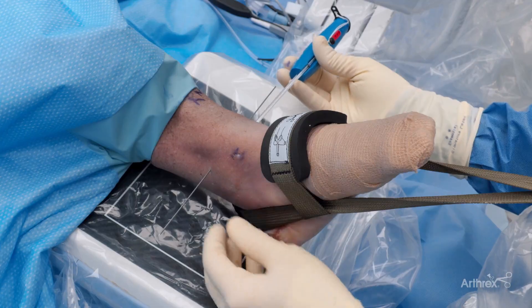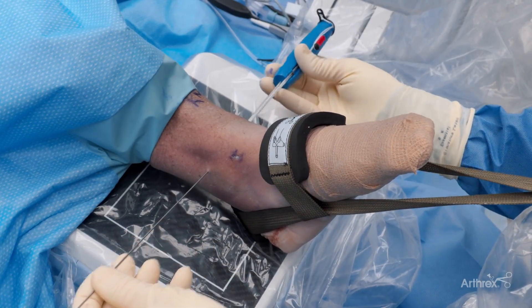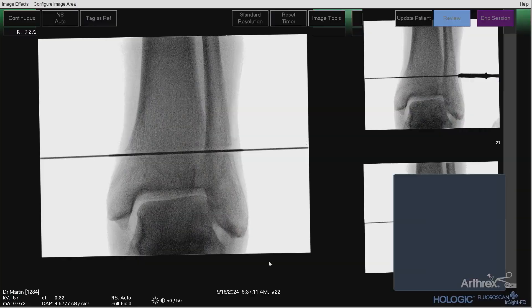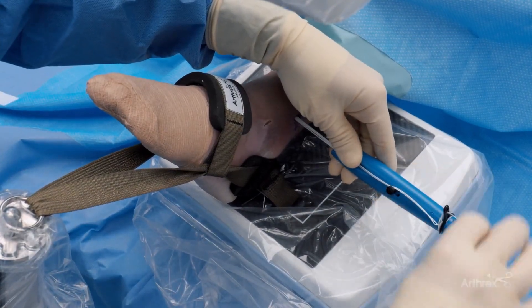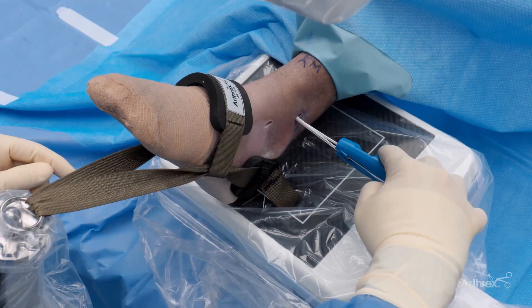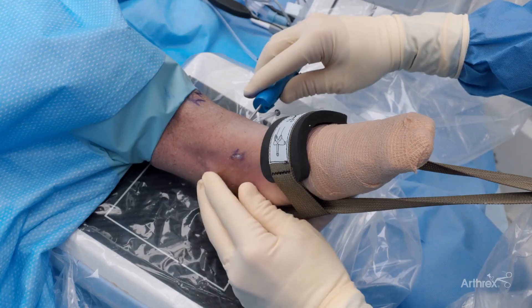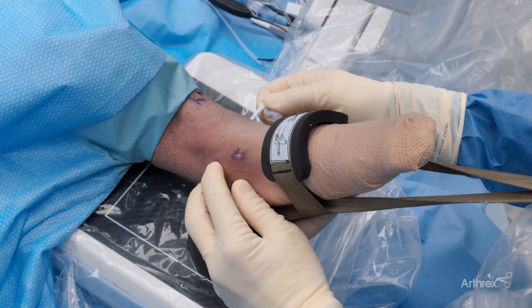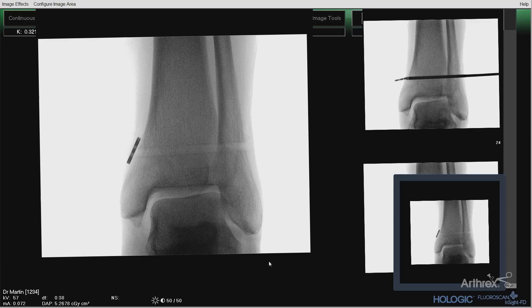Now that we've drilled, we take our Arthrex XP with the red button facing us, pull our guide wire out, and follow directly behind it with the button. With a gentle rotation, we slide it across. When you feel it on the contralateral side, take a small fluoroscopic shot to ensure you're through. Then take our red tab, pull it off, and pull back on the button — this releases the button immediately, and we can see the fluoroscopic change. The button is now disengaged and along the far cortex. Our handle can be removed, and we slowly pull down, manipulating soft tissue on the inside of the ankle. You can feel the button slide down nicely as tension is added, and the button is laid directly on the cortex.